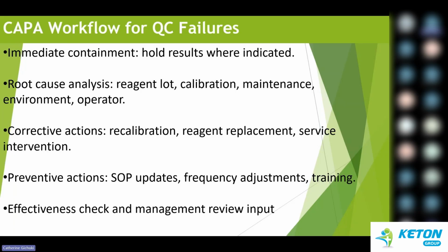Usually when you're running QC, we are bound to fail. Sometimes we find QC failures. So what do we do step by step when QCs fail? Because what we are doing is to protect our patients and prevent the problem from happening again. We are protecting them and then preventing it from recurring.